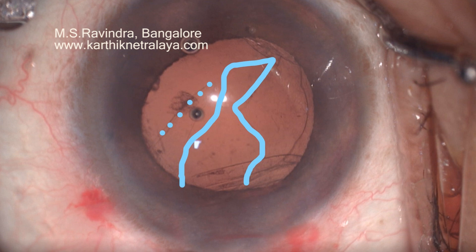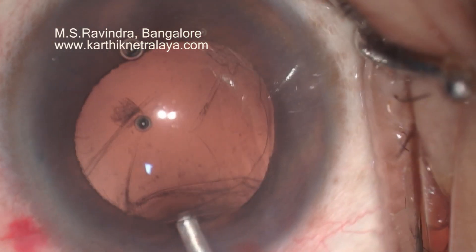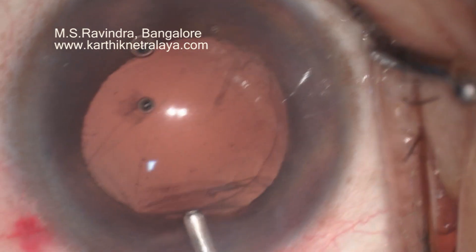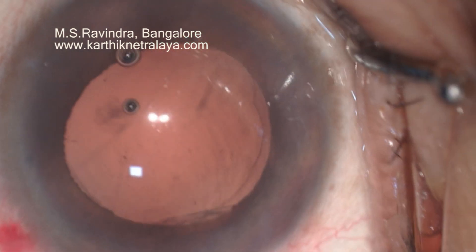You can see the folds of the capsule, but the hyaloid face is intact. I am hoping that the hyaloid face will remain intact. There is a prolapse of the capsular bag at 6 o'clock in addition to the tear that you see in the posterior capsule.